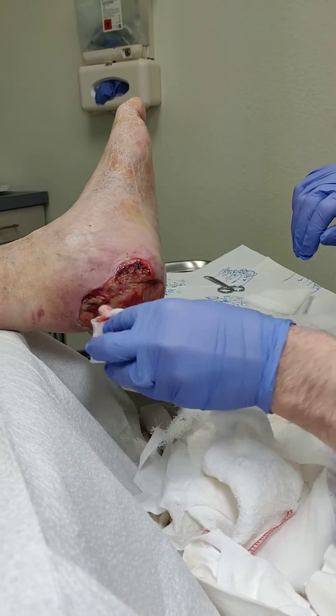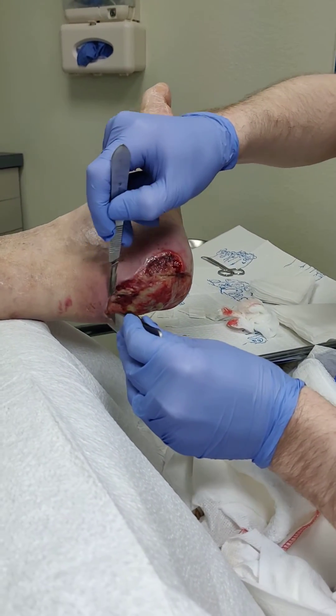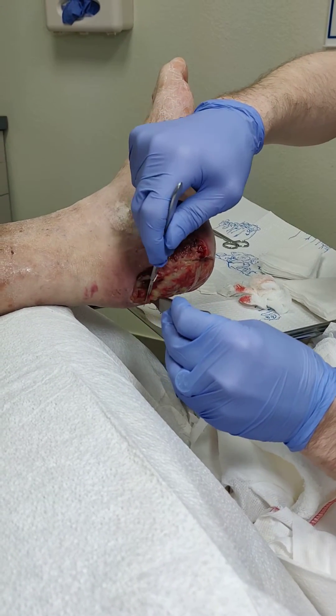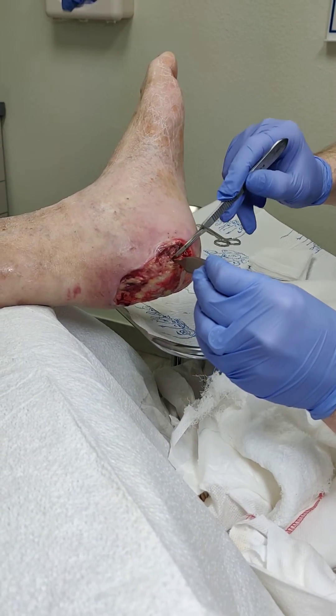Right now we're just using a little light debridement here to make sure we get all this freshened up a little bit. Without blood flow, nothing heals. Our patient has good blood flow, as we can see as we debride some of this fibrous tissue — we see a little bit of blood, and that's exactly what we want to see. Without bleeding, there can be no healing.